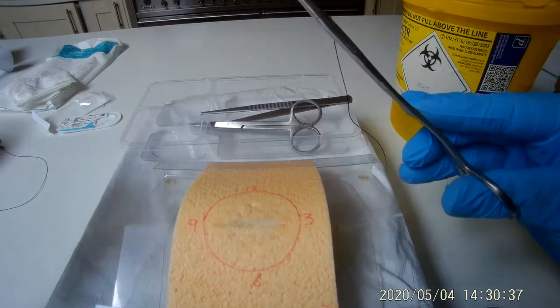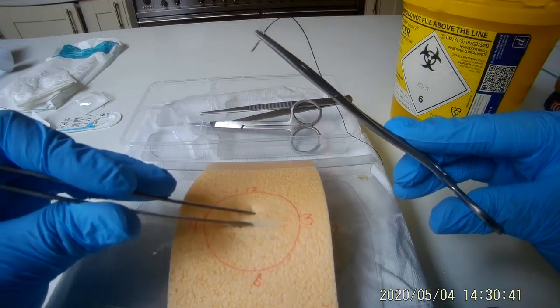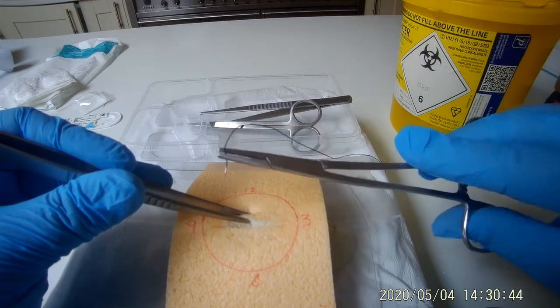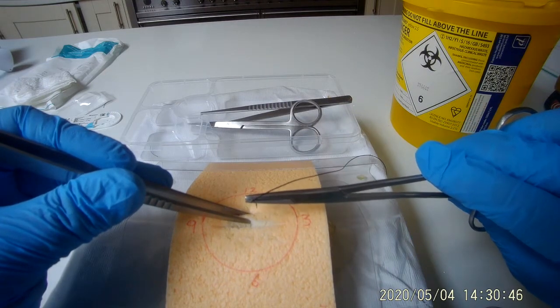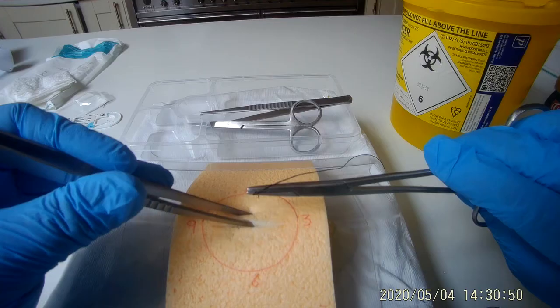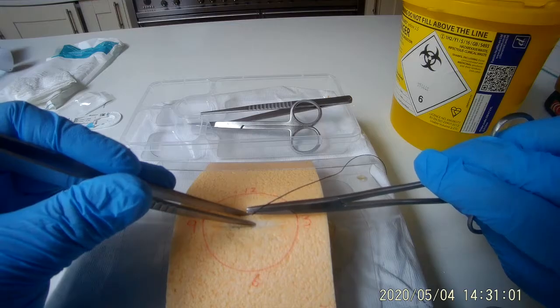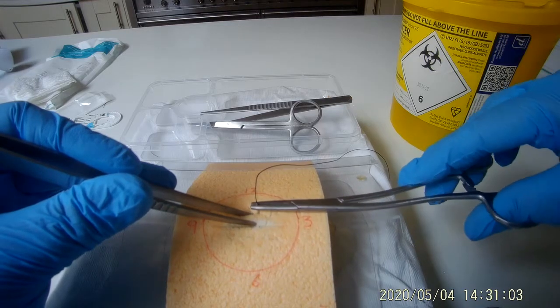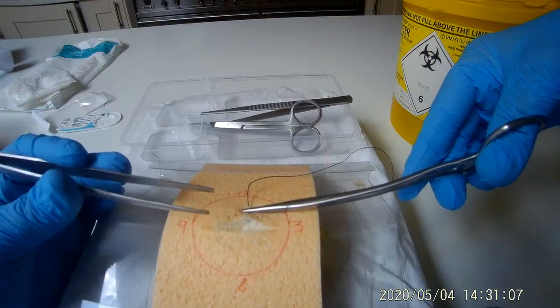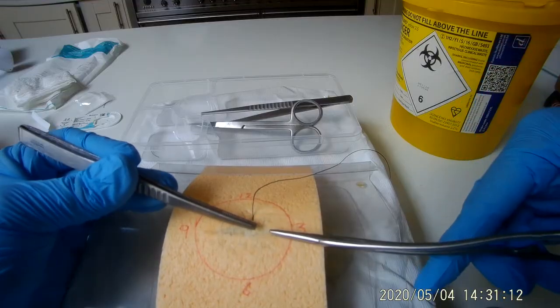Use your non-toothed forceps to grasp the edge of the wound furthest away from you. Pierce the skin with the needle at a 90 degree angle, approximately half a centimetre away from the wound edge. Rotate your wrist to bring the needle up through the middle of the wound. Grasp the end of the needle with the non-toothed forceps and pull it through.